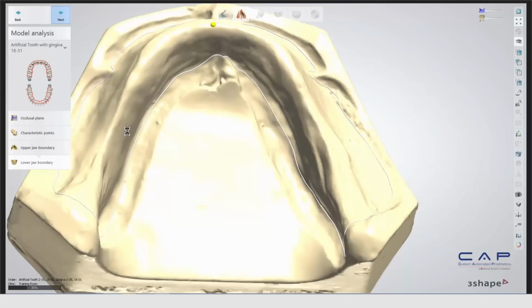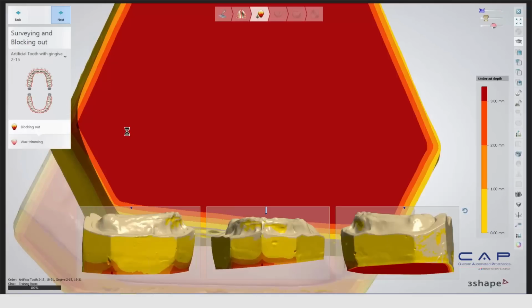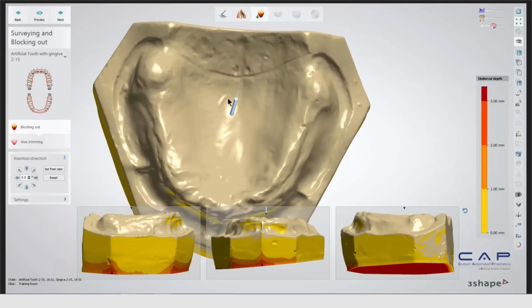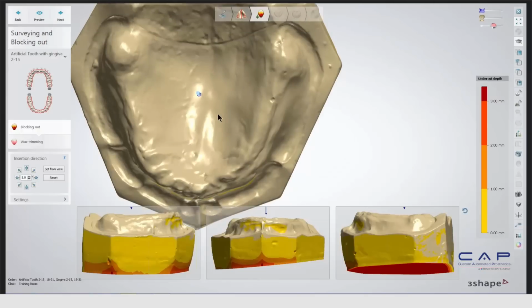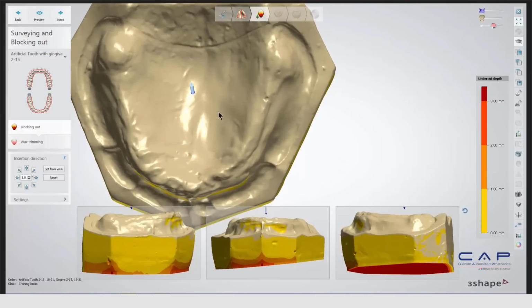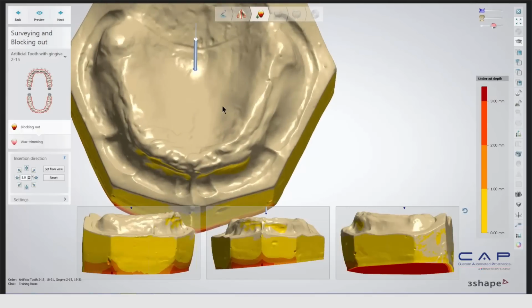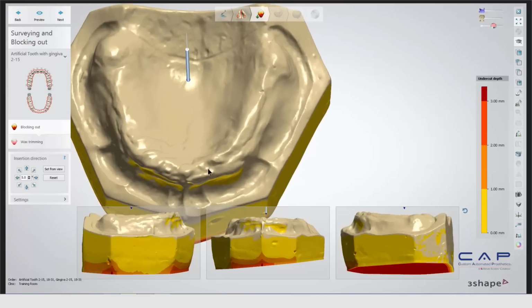So next stage we're going to go into the blocking out or waxing out our undercuts here. So the first thing that we need to do is we need to determine the path of insertion for our models here. So first I'm just going to go ahead and look, make sure I can tilt it back a little bit more. So we're going to tilt it like that to minimize the undercuts here.